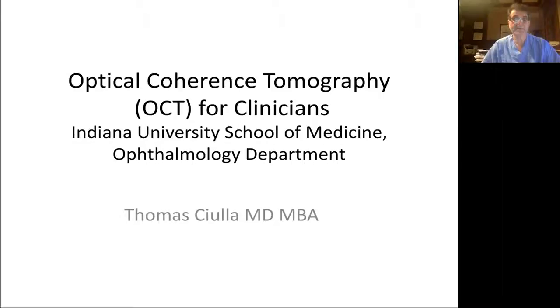Another question, a simplified reference to learn OCT. Again, you can download the reference I mentioned on the CyberSight website, and that would be a good starting point. Of course, just looking at lots of OCTs will help. Next question, is there a specific definition of SHRM? Yes, it's hyperreflective material between the retina and the RPE.